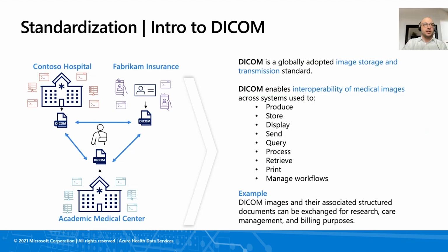And as we talked about what a DICOM object is and the different levels or hierarchy in DICOM, I also would like to say that the DICOM standard is not only used to store the image in a given modality or on a given archival system, but also to transfer DICOM objects between entities. So from a Contosa hospital, your DICOM image can be transmitted to your payer or another academic research center to get a second opinion.